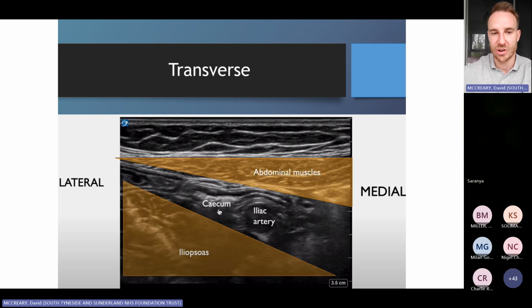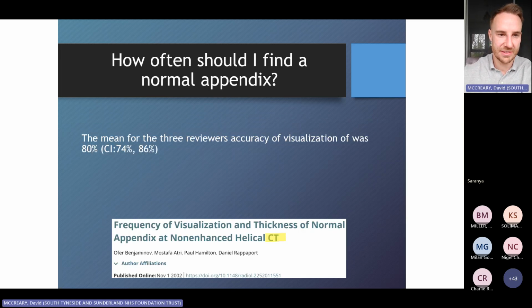When we're doing a femoral nerve block in real life, particularly in pediatrics, they definitely tend to sit one on top of another. So in this case, the vein will be down here. And then we've got a bit of dirty gas pattern from the cecum that might just arise between the muscle layers. But what we're looking for is this tubular structure projecting out, a kind of blind ending tubular structure. It won't have any peristalsis, and you've got to interrogate every single little loop that you see. So let's have a look at some examples.